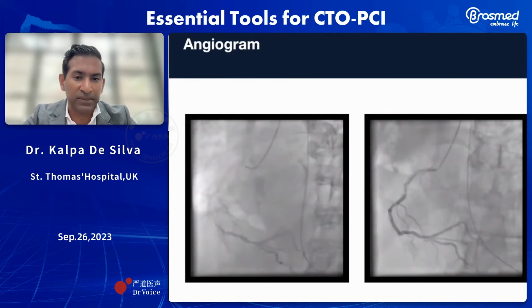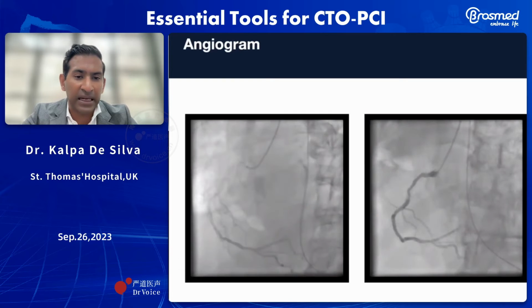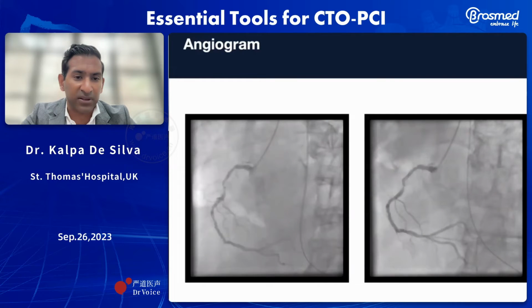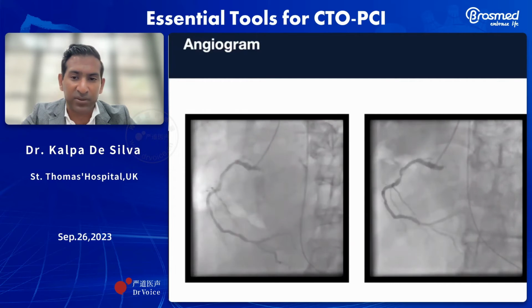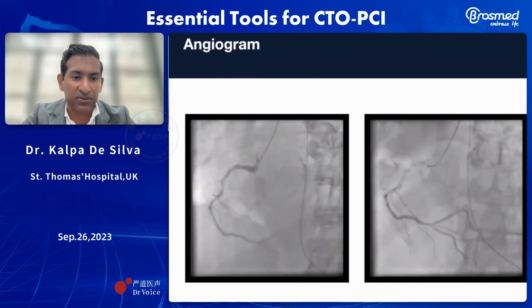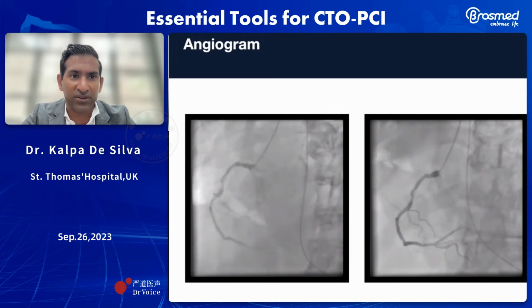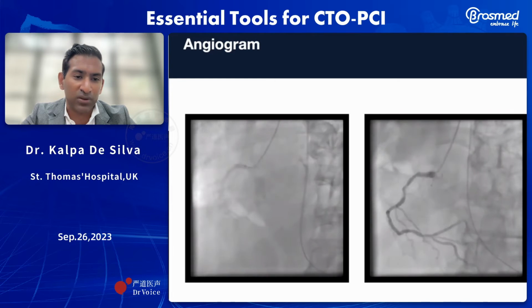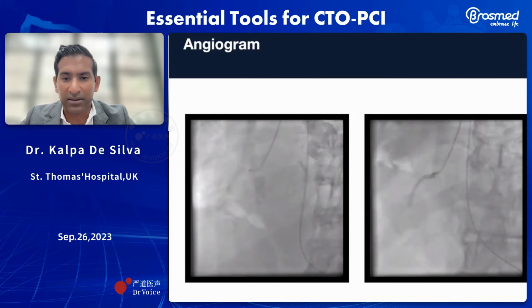This is his right coronary artery. You can see in this panel there's calcification in the left system. And in fact, this gentleman had a mid-LAD CTO. And so this was essentially his last remaining vessel with a relatively small circumflex in the left system. So this is a really critically important artery for the patient. You can see the calcification within the vessel wall and what looks like a fairly focal lesion, but a long length of disease within the angiogram on the two views observed here.